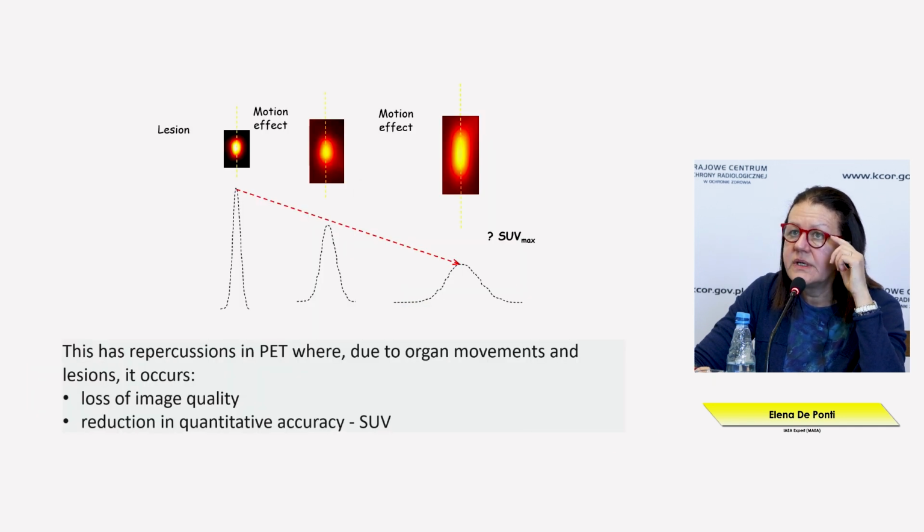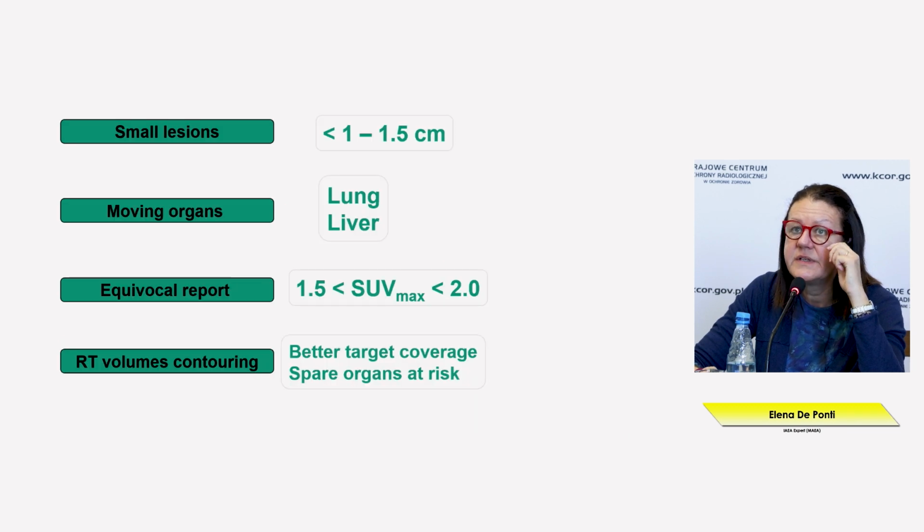So many different ways to correct for movement have been described and introduced, and can be used. And the last one is a tool of artificial intelligence. They have been described in the recorded presentation. I think that if you have any questions, we can talk about it later.